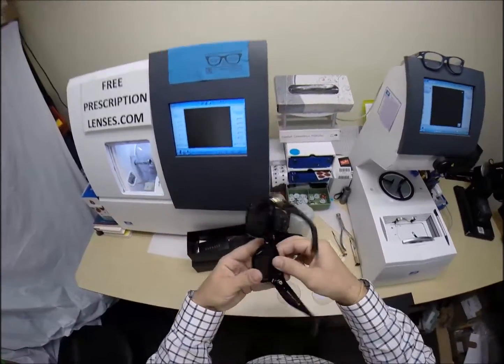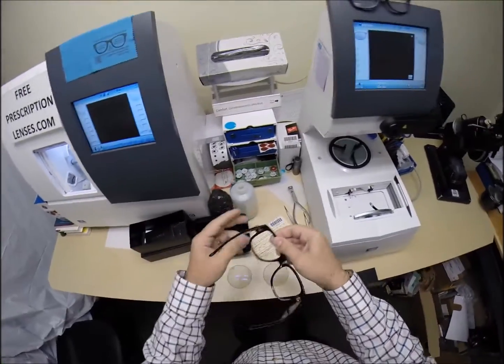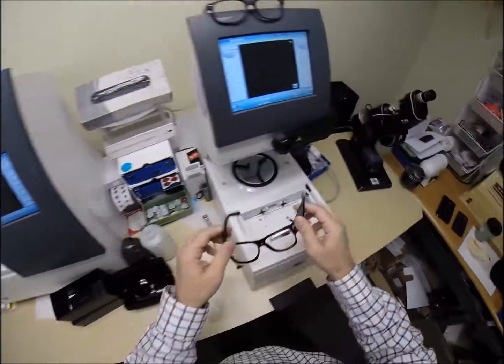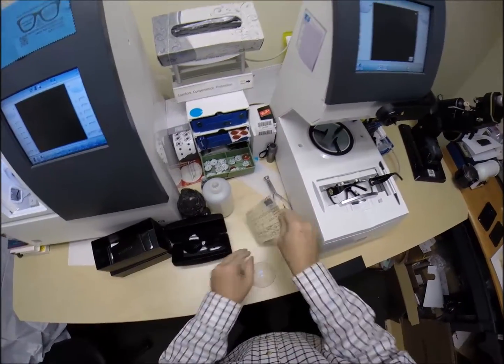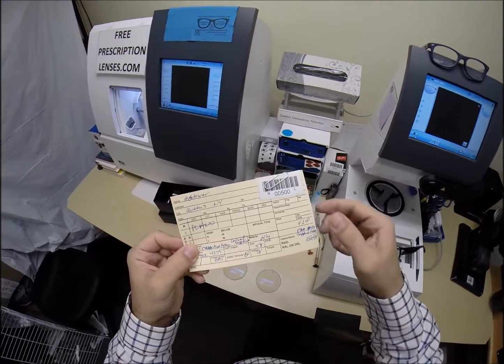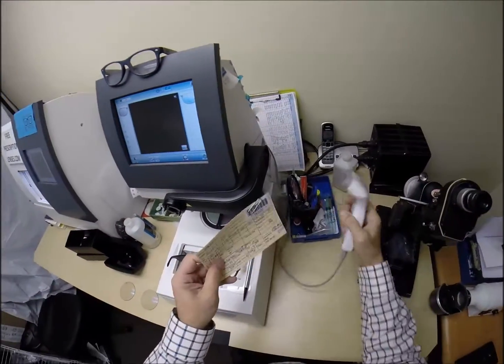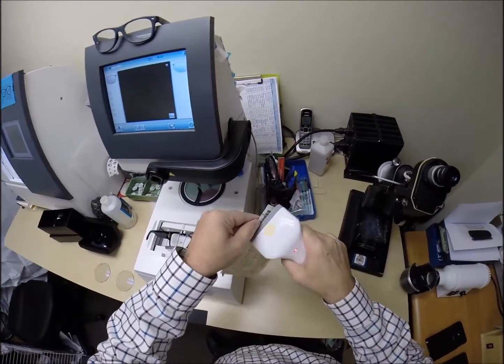Let me go ahead and pop out your original demo lenses. Put those in there. And I'm going to take your frame and put it into the tracing element of my blocker. Now, we're at a milestone here. You're at number 500. Hightower, you were Secret Agent 500. Now, I'm going to enter this into the computer. It's going to be scanned. If the paper clip's not in the way, let me move that.